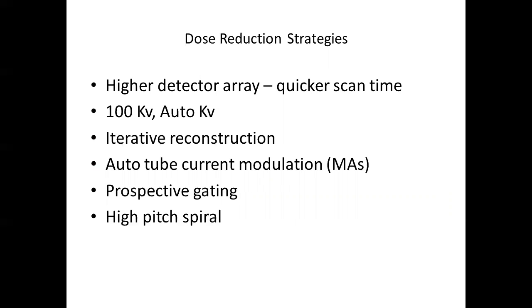So now we will very rarely scan higher, and this will depend on body size and such, if you need to penetrate more. Standard imaging is at 100 kV, and this just drops your radiation by a factor of 2, at least. Also now most of the scanners have something called auto kV, which is, if somebody is being lazy and not putting in the lower kV, it'll just pick it itself. So now the scanners will just pick a kV by themselves. I think it's kilovoltage or something. Yeah, right, so it's a voltage term.